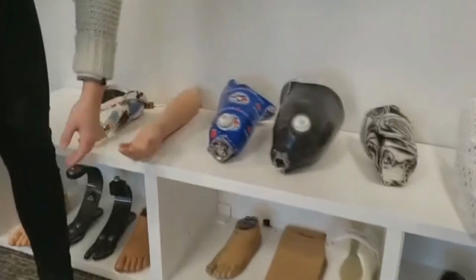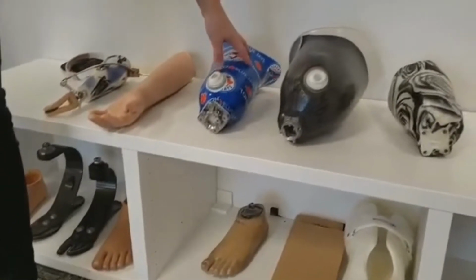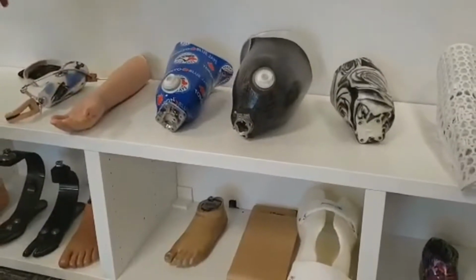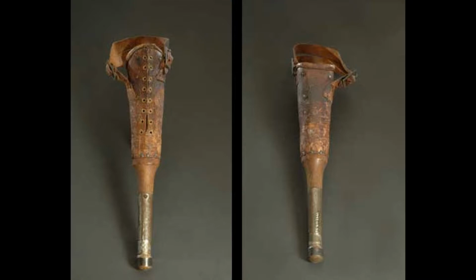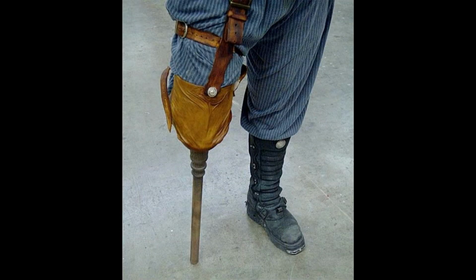However, this wide selection of prostheses was not always available, and for much of history, devices were crude and simple, lacking the refinement present in today's designs. Early designs were limited by materials and the science behind them, and simplistic wood, metal, and leather devices such as the hook hand or peg leg were widespread. These devices were heavy, unwieldy, and of limited functionality. Moreover, their high cost generally meant they were only accessible to the rich.